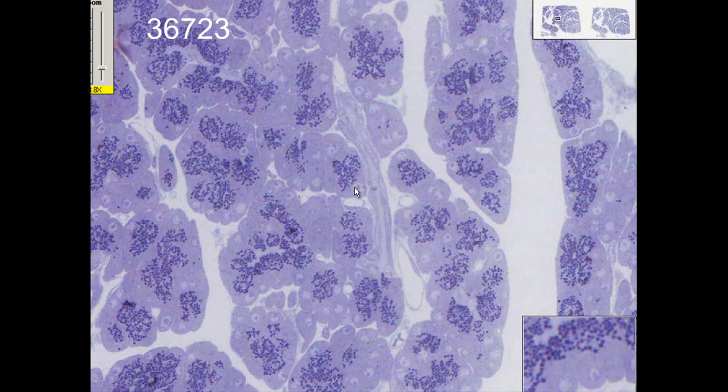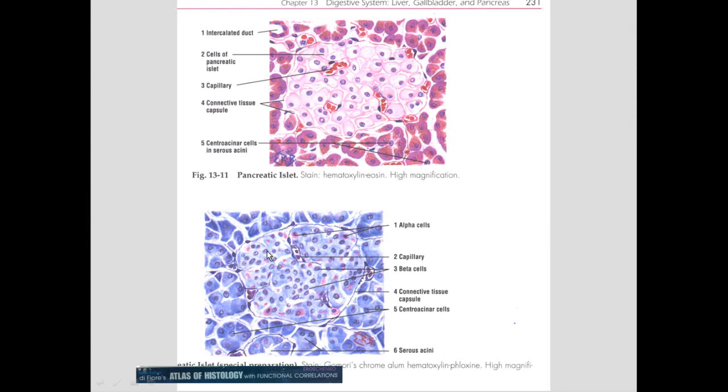We can also see a nice big pancreatic acinar cell with a big nucleolus there, and the granules in the apical region to be discharged into this lumen here, which appears gray. So this is where you get concentration of the granules and then condensation of the contents, so that it is discharged into the lumen.